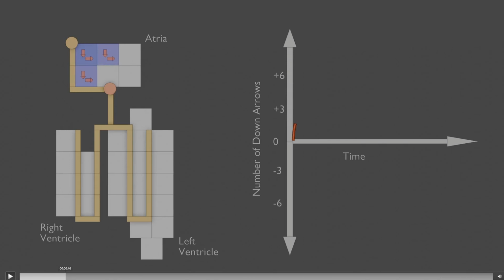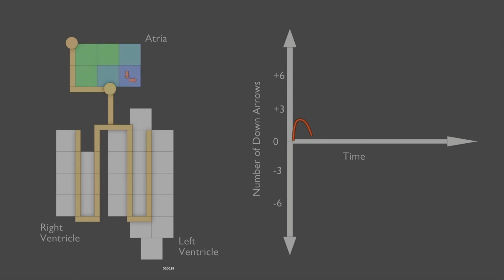As that impulse continues over the atria, we can watch what happens. So 3 cells are lit, giving us 1.5. Our maximal point is going to be 4 cells lit, giving us 2, and then it swoops back down. So the wave on the EKG created by the atria is this smooth, curved wave, and that's our initial depolarization of the atria.